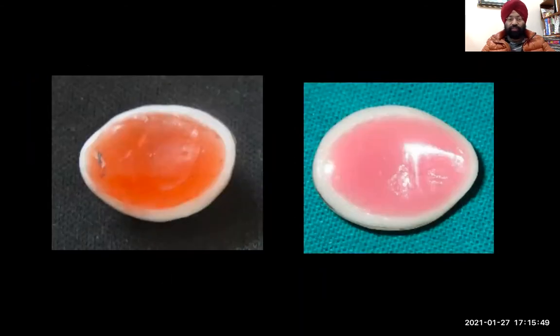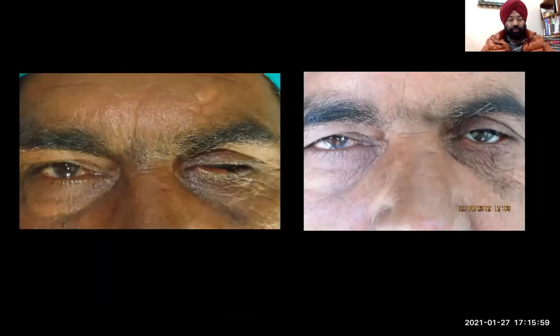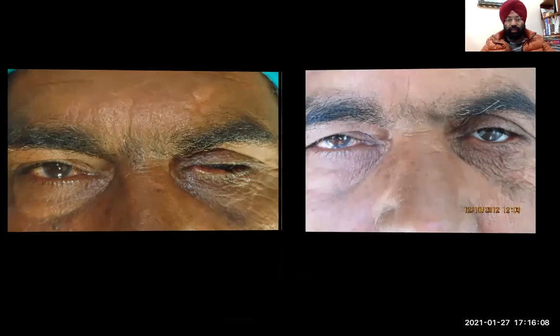The master impression was done, and this is a stock eye with the back surface showing modeling wax, and finally acrylized in resin. This is the final outcome you can see. This case was done in 2012 and the patient is still wearing the ocular prosthesis given by us.